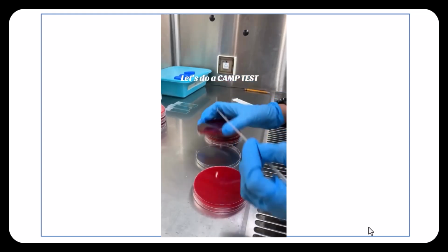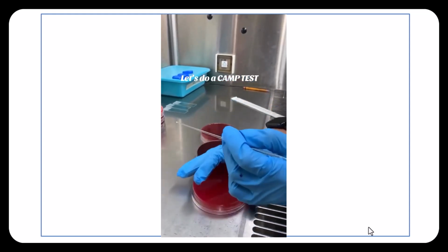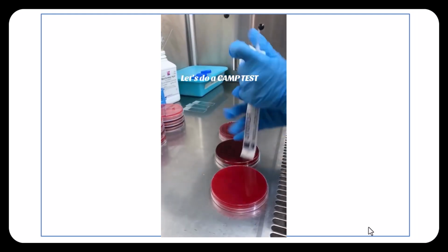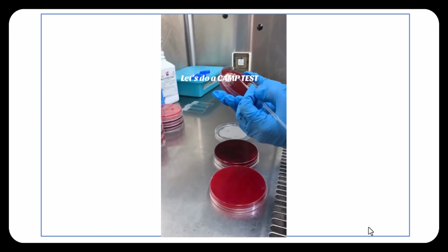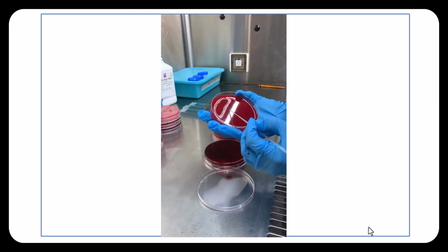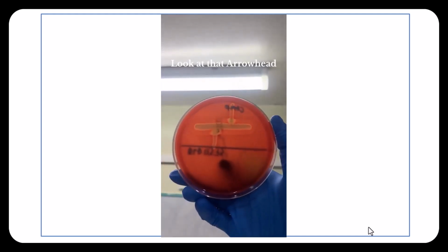The procedure of the CAMP test is very simple. We take a straight line of Staph aureus on a blood agar and then take the test Streptococcus and streak it perpendicular to it, leaving a gap between the two streaks, and incubate it at 37 for 24 hours. After that, we observe the result. The arrow shape indicates a positive result.